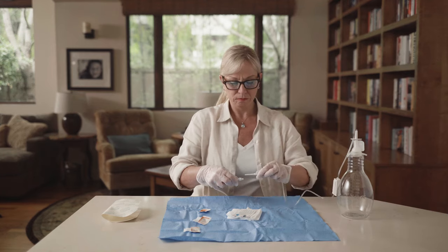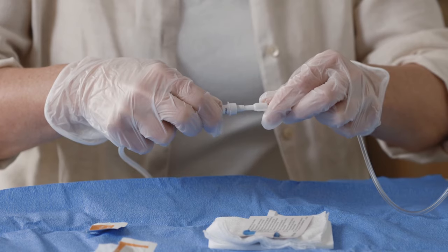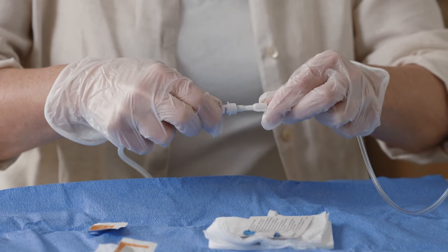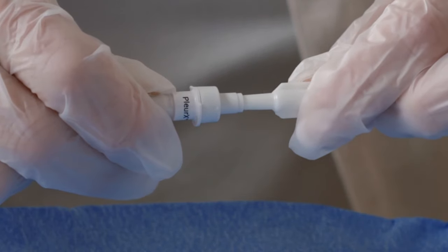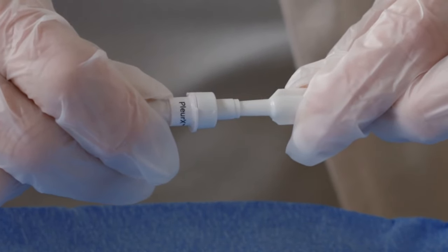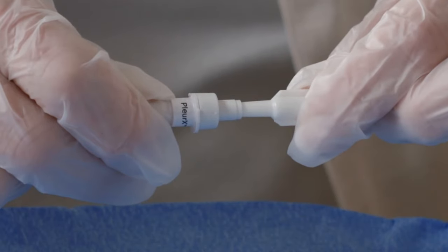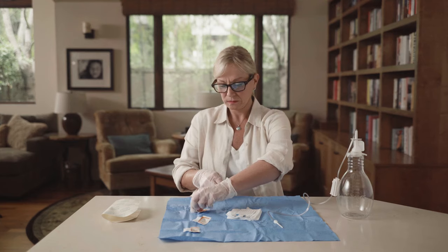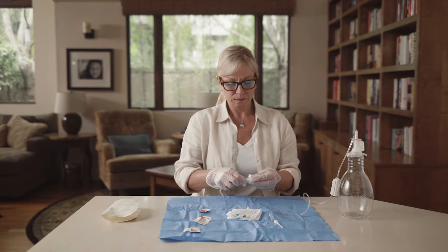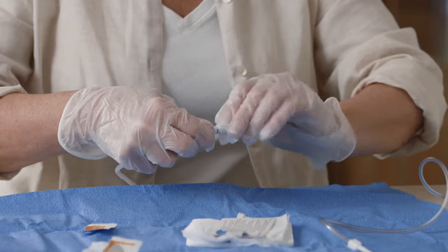While holding the catheter, pick up the drainage line near the access tip and gently insert the tip into the end of the catheter. You may feel and hear a small click when they securely connect. Make sure that the valve and the access tip are securely connected when draining. If they are accidentally separated, they may become contaminated. If this occurs, clean the valve with an alcohol pad and use a new drainage bottle to avoid potential contamination.